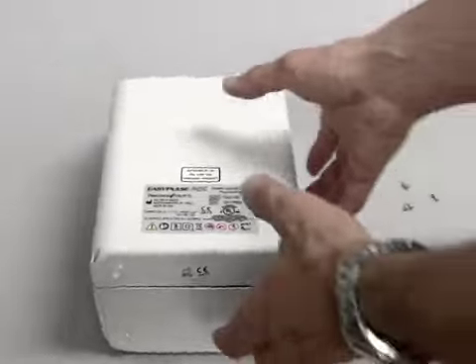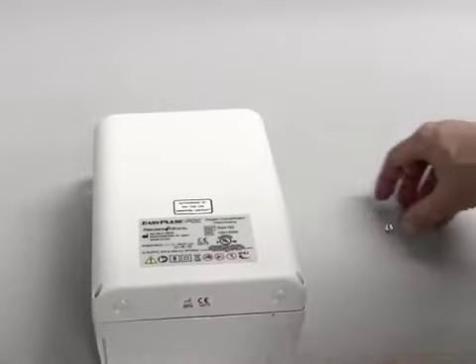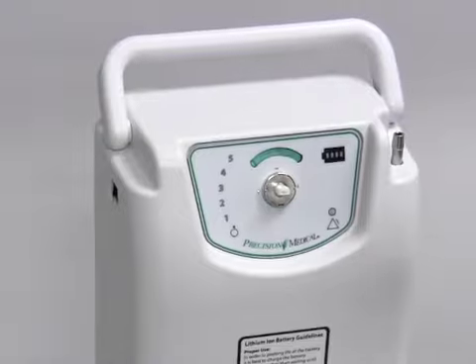This shows that I've now put the back cover back onto the sieve bed assembly, and I'm ready to put the 4 screws in place. The last step is to reinstall the knob assembly.